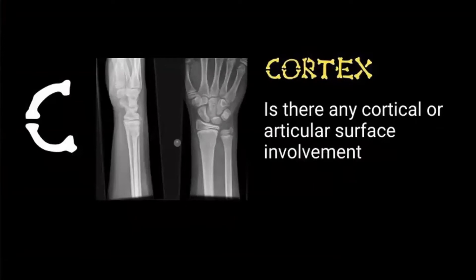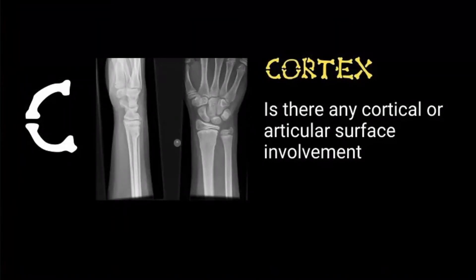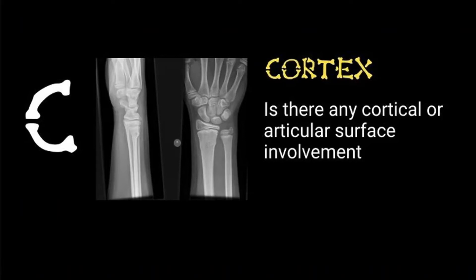C — thinking about the cortex. We're talking about paediatric minor injuries here today, but the principles still apply elsewhere. Is there cortical or articular surface involvement? Looking at this x-ray, it's got a nice buckle fracture — you can see that classic bump on a bone.